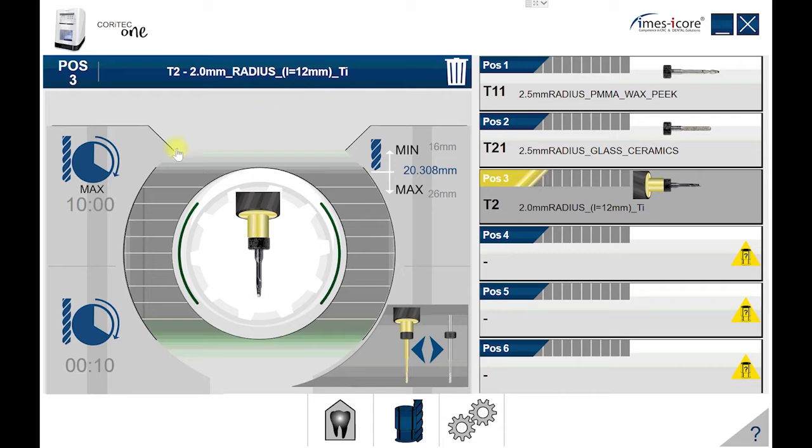The next section on this information page to take notice of is the total estimated life of the tool. Below that is the total time spent on the tool. In the upper right corner of this informational section is the minimum and maximum lengths of the tool. The number that appears in between the min and max numbers is the actual length of the tool. Right below the measurement information, there is the button to tell the mill to pick up the highlighted tool.